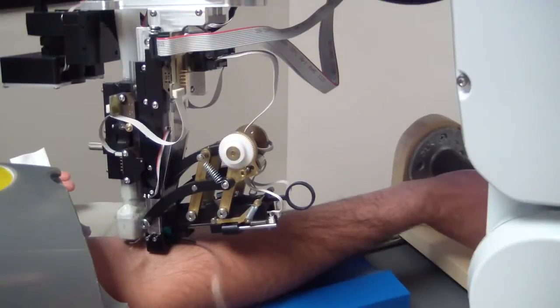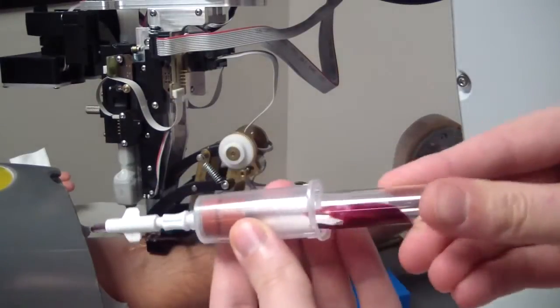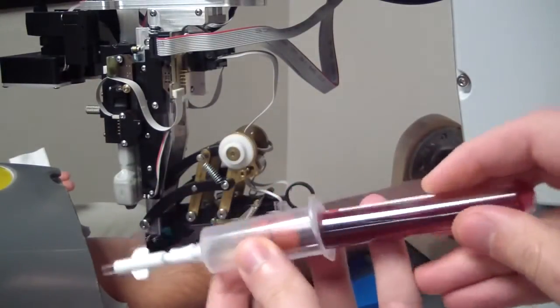Phlebotomists, the medical technicians who take blood samples, are getting some competition. Meet V-Bot, a medical robot that draws blood.